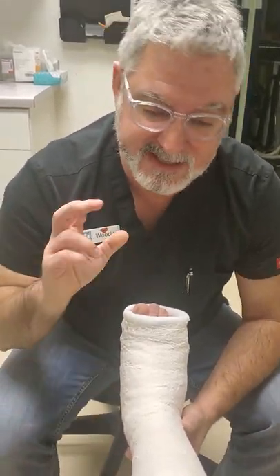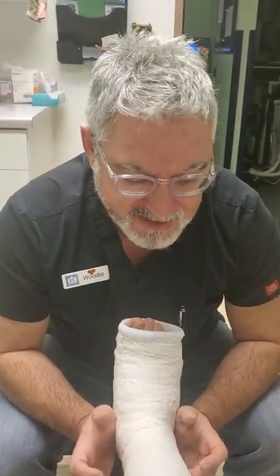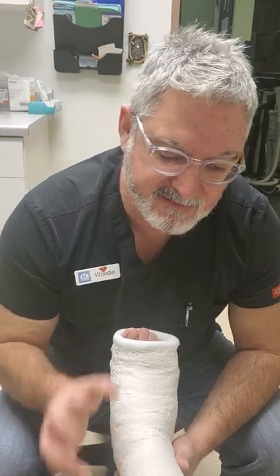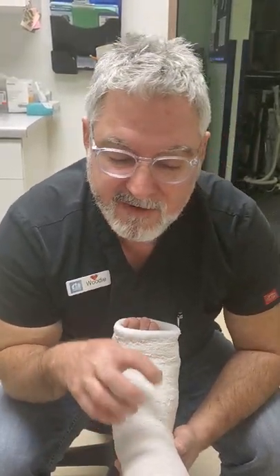As we all know, there's essentially only one safe way to get a fiberglass cast off, and that's usually the cast saw. You'll see people try different home methods, which we don't recommend and it's not safe. Differing from the fiberglass, with plaster there are variations on how you can take a plaster cast off.